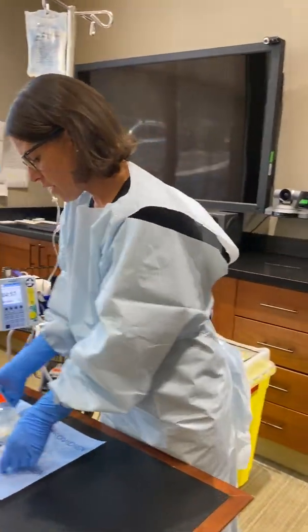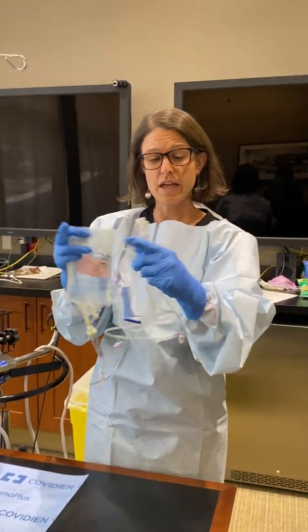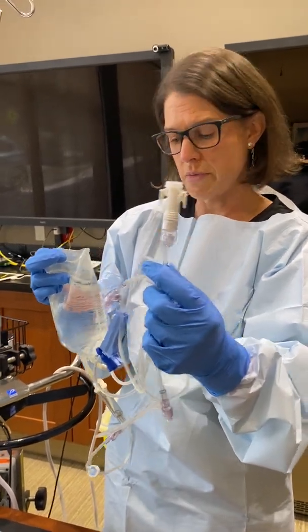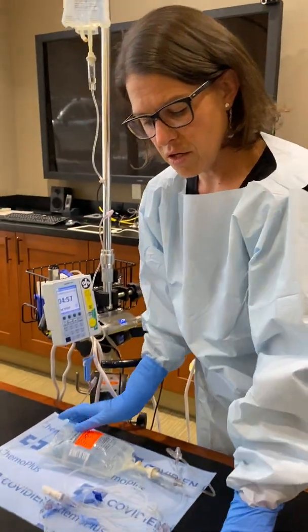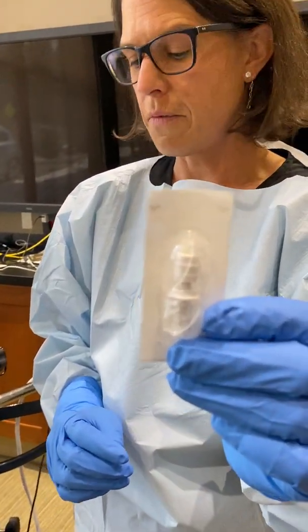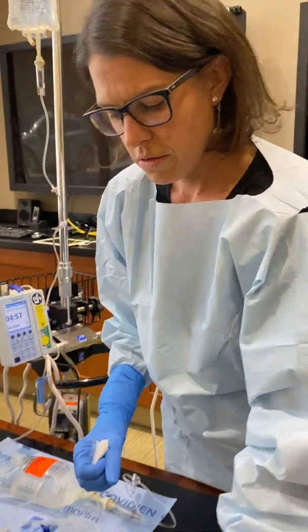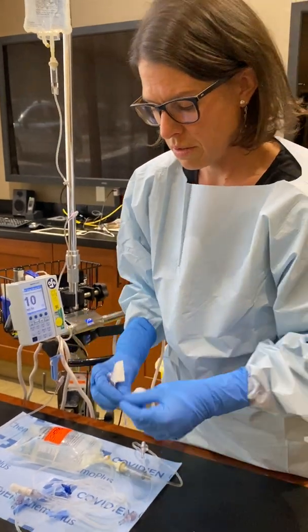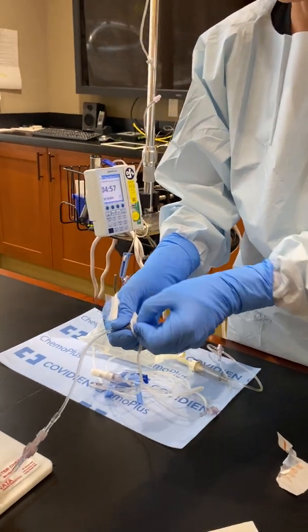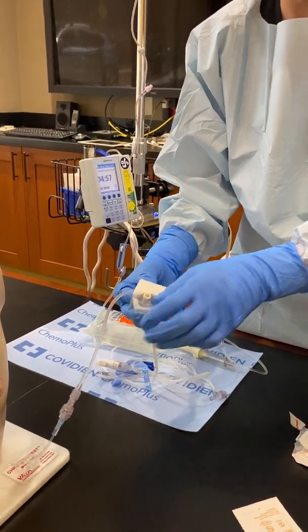With your chemotherapy, all of your medicine should come primed in the bag, and you'll notice that we have these connectors that come on the end of chemo. This piece comes from pharmacy, and then the piece that you have on the chemo cart goes onto the port — the hub — that you have on the IV fluids. You want to use the hub that is closest to the patient, and generally all of your chemotherapy is going to come in a primary. You'll hook it up as a primary as opposed to a secondary.